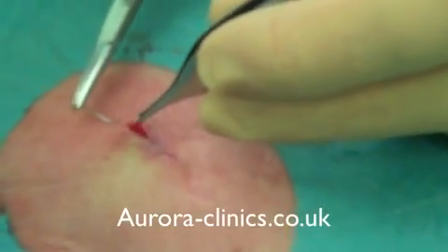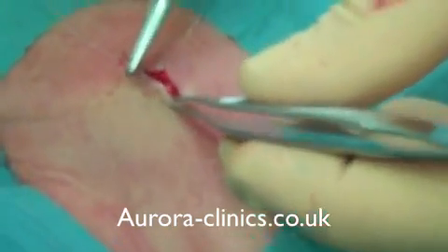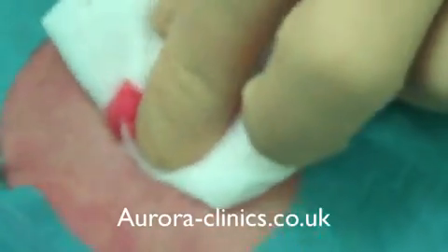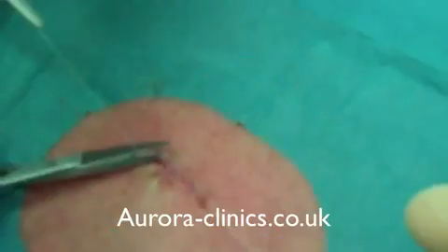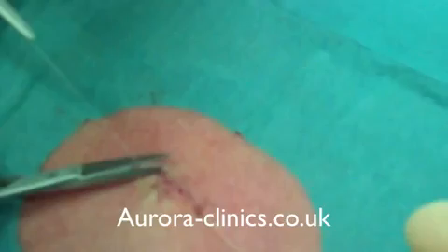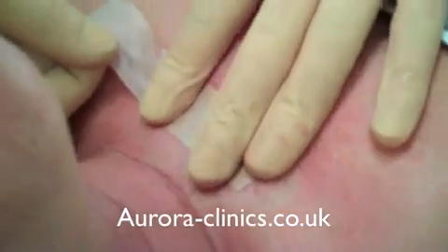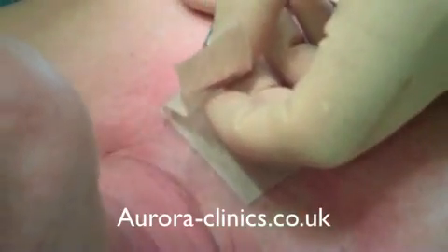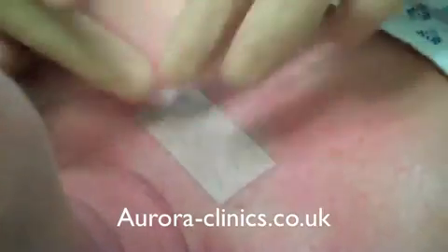The final layer of closure is a subcuticular PDS. This is probably a 5-0, and I just run that along. Again this has got no tension on it. That's the important point: no tension on the skin. You can see there, that's where I'm going to cut the stitches after surgery. Here's the glue on, and finally here's the micropore tape, which we like to keep on for one week following surgery, and then that comes off and the ends of the stitches are trimmed.